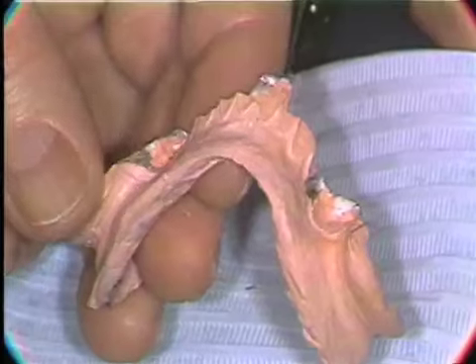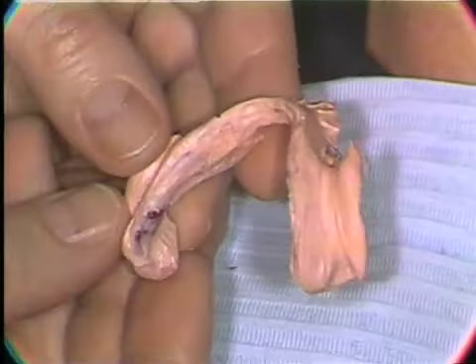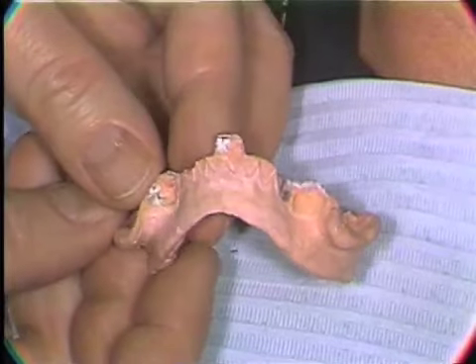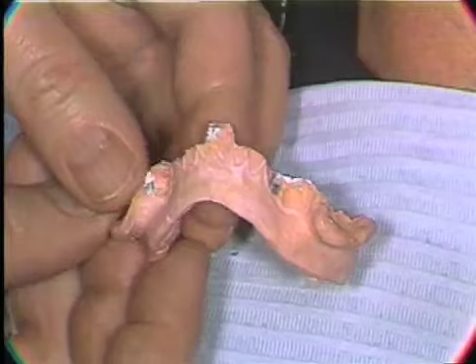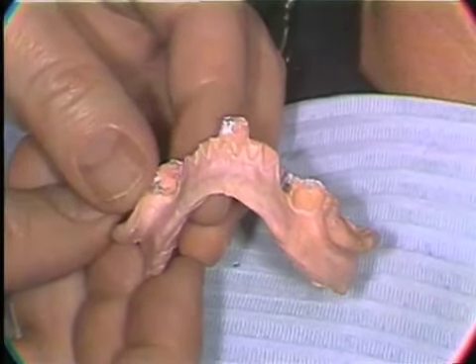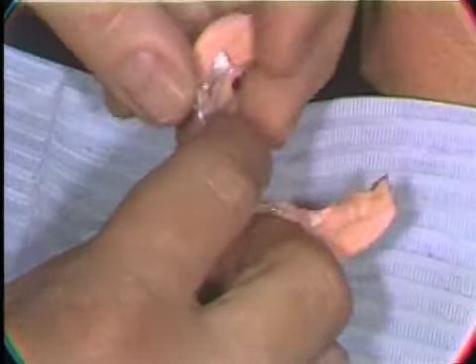So now we would go to the mouth, check the stability of the impression in the mouth. So now we have an accurate impression from looking at it. What we want to do is to place this in the mouth and check to make sure that we have a stable impression. We want to start verifying our stability right in the impression stage. This is why we like a hard material, as we can place this back in the mouth now, please.